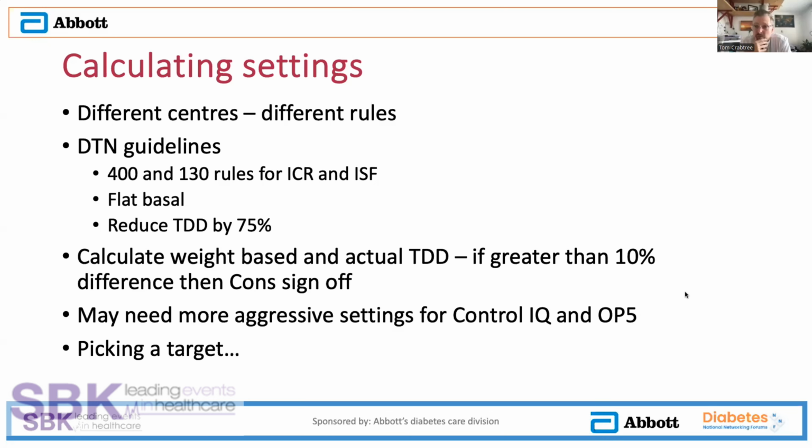Or if you've got someone with severe hypos, you may want to set a normal target still. Sometimes they want lower targets, and the lower targets might stop them from interfering with the pump and doing things like fake carbs. So that's also important to bear in mind.